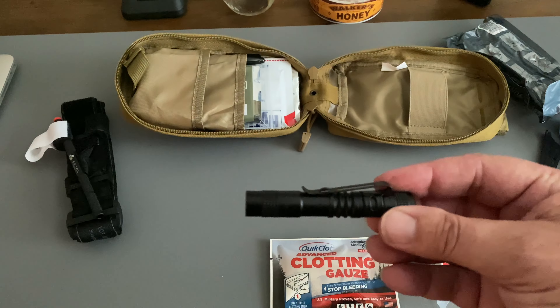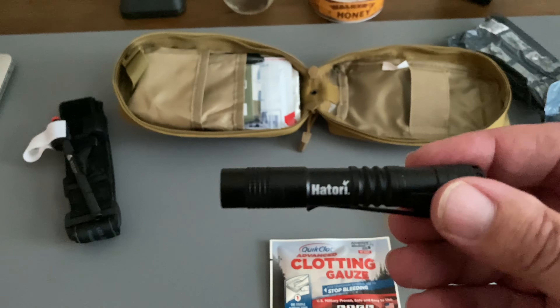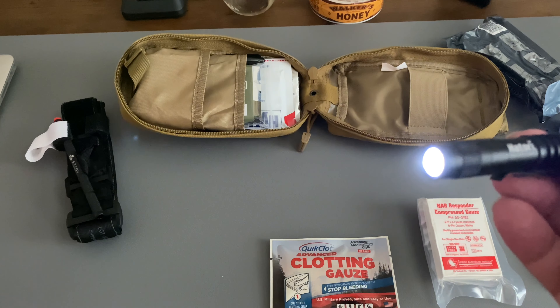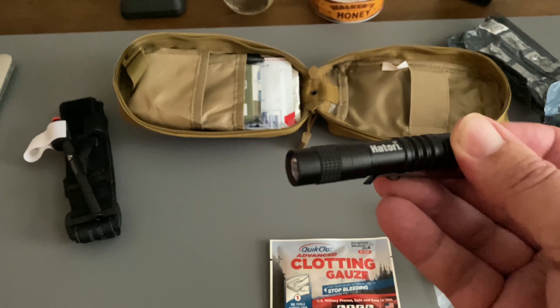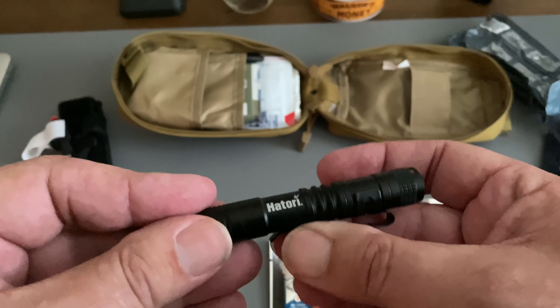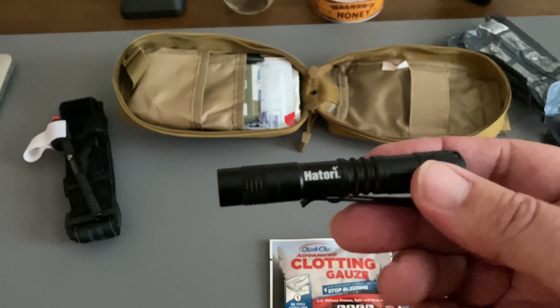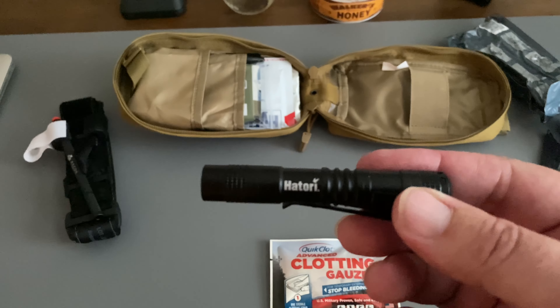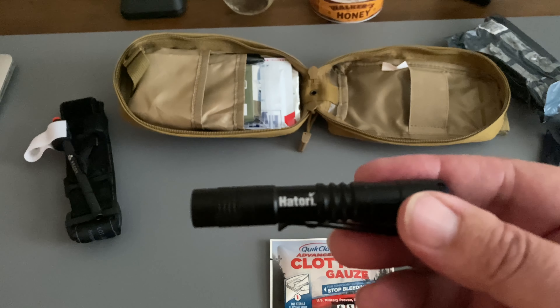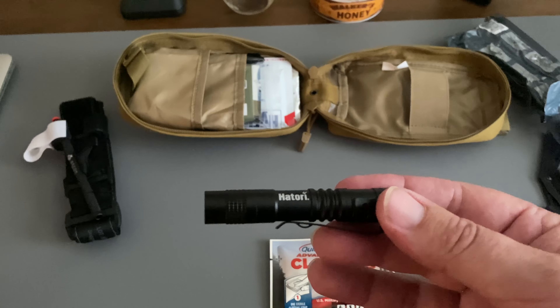We have a little pen light here — Hattori. Got that in just for this bag. It runs on a triple-A battery and has a nice little belt clip on it. You can reverse it, put it on your ball cap or whatever. Why would I have a light in here? Well, not everything happens during the daytime, so you may need a light to see what you're doing while you're trying to help somebody out.